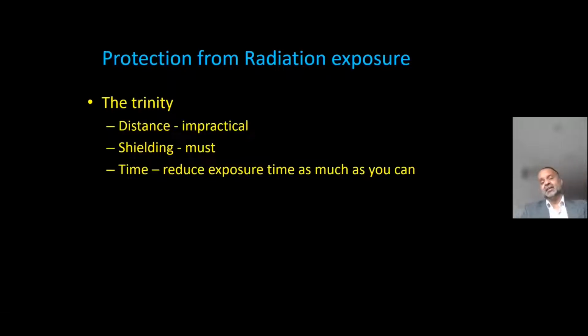Now, there is obviously a third element to this. There are three main elements, really. But the first element, especially if you are the operator, the person doing the procedure, is quite impractical. That is distance. But the distance actually reduces the radiation quite significantly. For everybody else, it is quite important. So all your theater staff, you will see a lot of the radiographers will have these buttons on a long flexible lead. So they will actually stay away from the machine when they are doing the exposure.